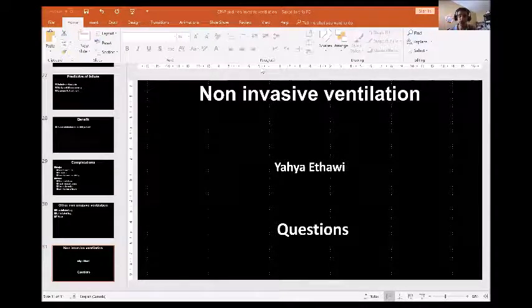When we have transport, when we have a nasal problem, for example cleft lip and cleft palate, when we cannot fit, or when we don't have a variable flow machine and generator, we use continuous flow CPAP.